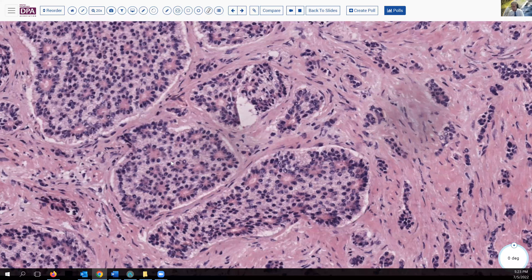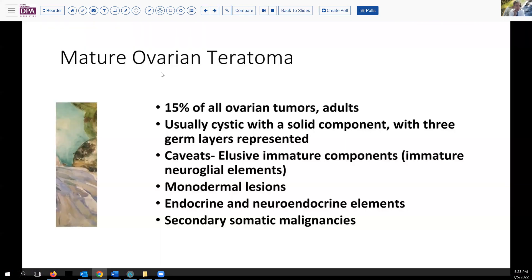That was the diagnosis that was rendered, illustrating one of the challenges in this lesion. Given that, they did some further sampling and peritoneal staging to make sure there was no spread. When we saw the final tissue, we decided this was still part of the teratoma. Mature teratomas are a significant proportion of ovarian tumors, usually in adults, with a mixture of solid and cystic components, usually with all three germ layers — ectoderm, endoderm, and mesoderm. The thing to be most aware of are those very elusive immature components, particularly if they have a neural glial component.